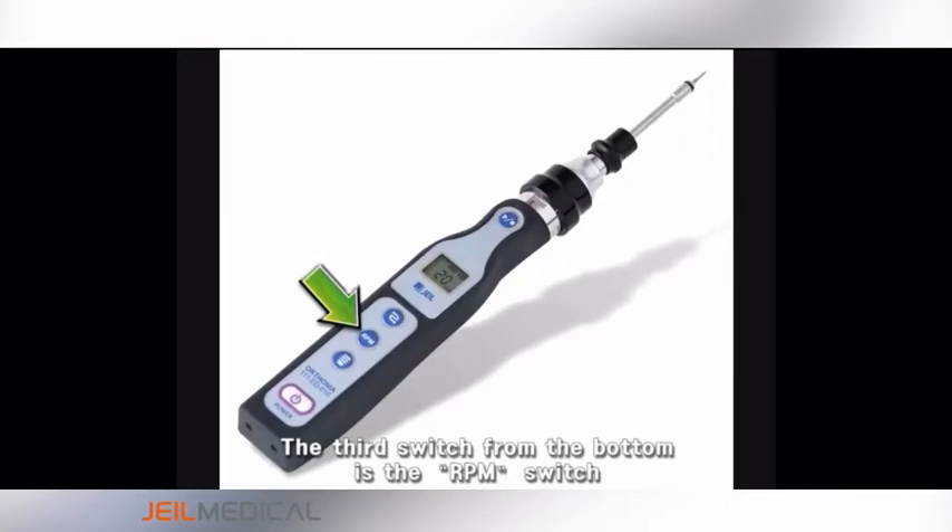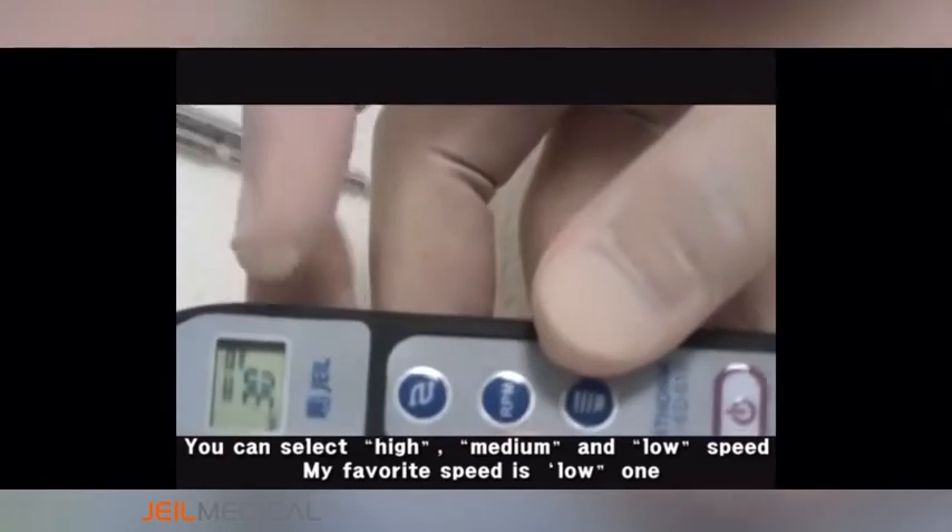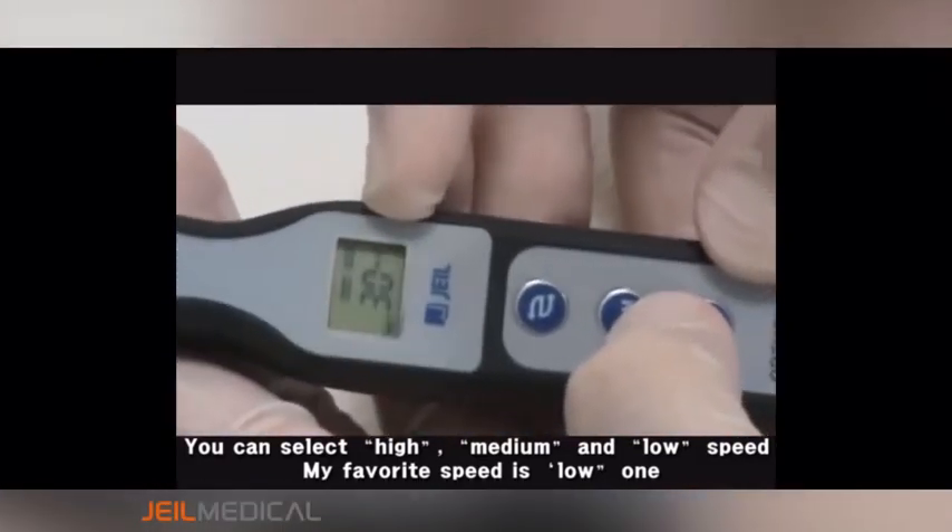The third switch from the bottom is the RPM switch. You can select high, medium, and low speed. My favorite speed is the low one.